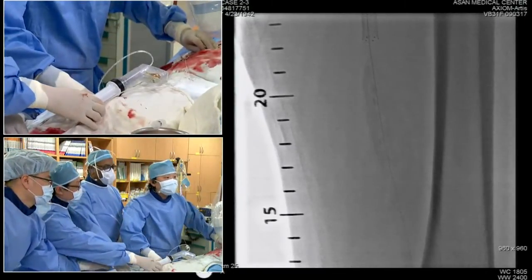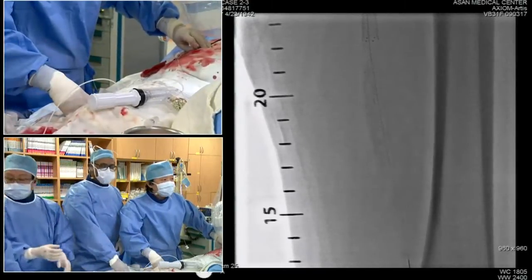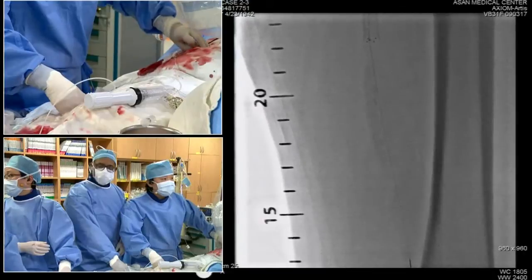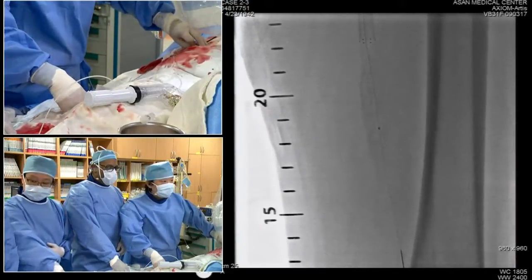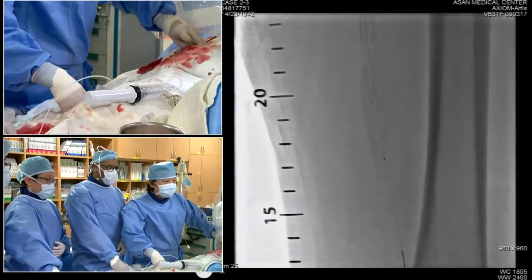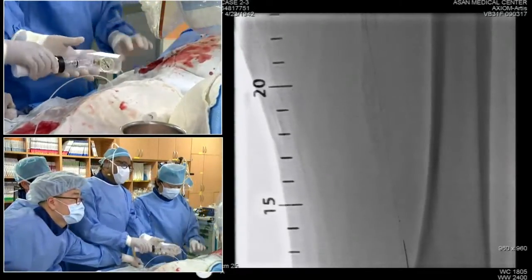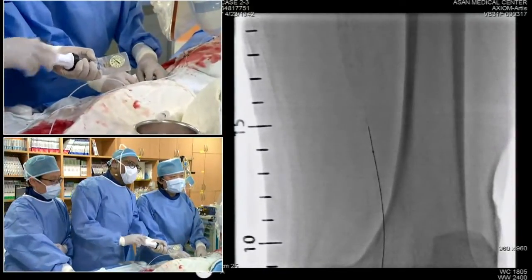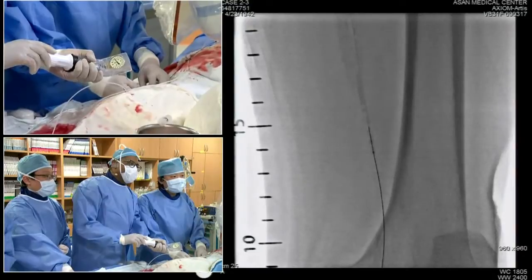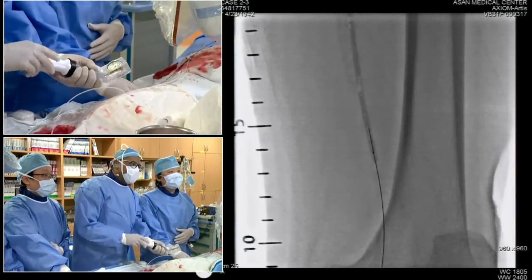A long wire, please. We need a long wire. V18. I push forward. So their issue here is they're trying to make sure they cover the distal reentry point and treat that, not knowing exactly where they re-entered. So what we're trying to do is find out where we re-entered, since it was not clear exactly.